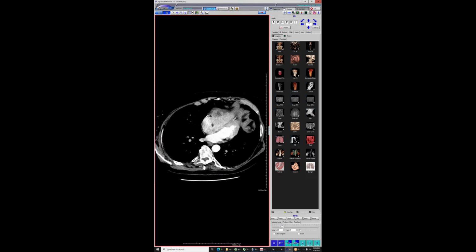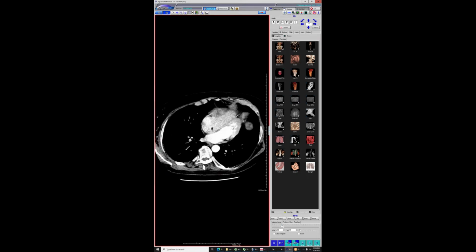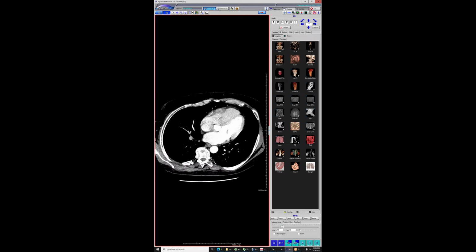Yeah, I mean, right, could he also have a pericardial meso? I guess, but those usually don't have a ball of mass. The ones I've seen are always infiltrated. They don't have a very focal area. Who knows? But yeah. All right, those are my cases.